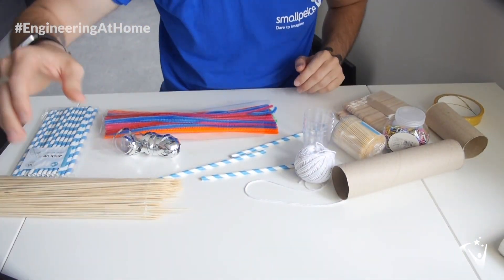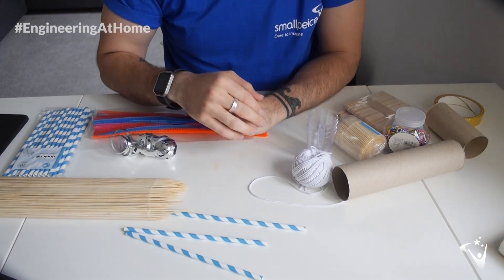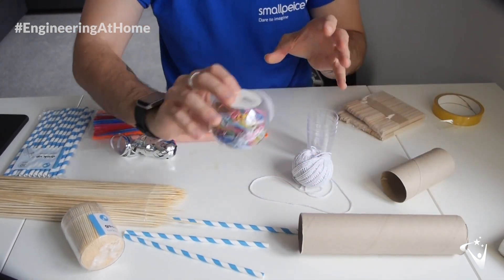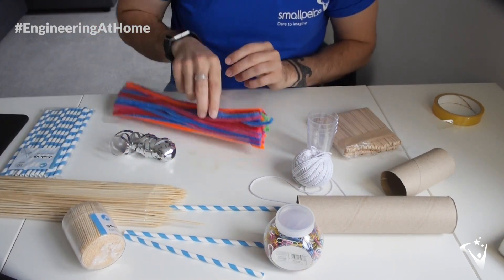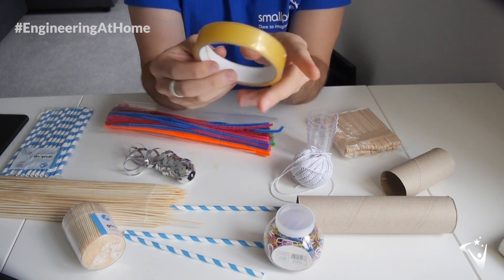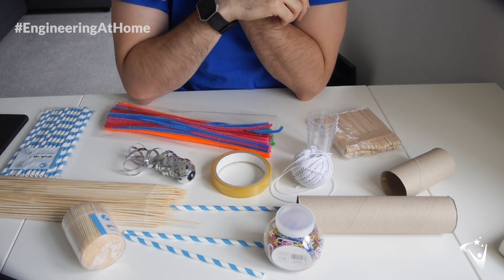Before we can simulate keyhole surgery we're going to need to make some tools. I'm going to try and fashion some sort of grabby devices and I've got various different resources here: straws, which I think are going to be key to my designs; bamboo skewers — do be careful, they're very pointy; cocktail sticks; various different tubes; cardboard tubes; paper clips; craft sticks; pipe cleaners — I think these might come in really handy; some ribbon; and sellotape, which I think is going to come in handy as an adhesive. So I think it's time to start crafting.